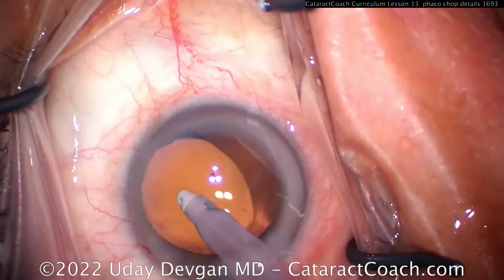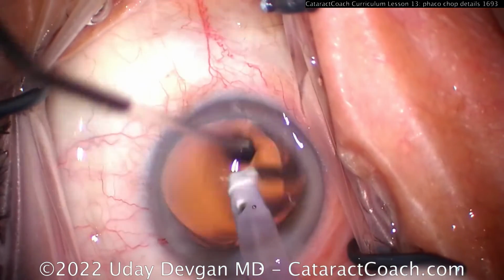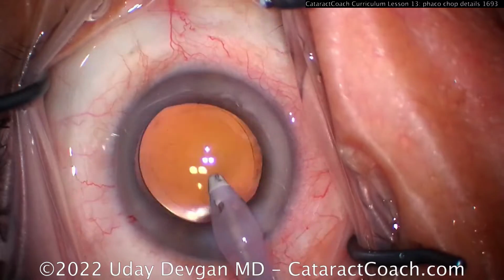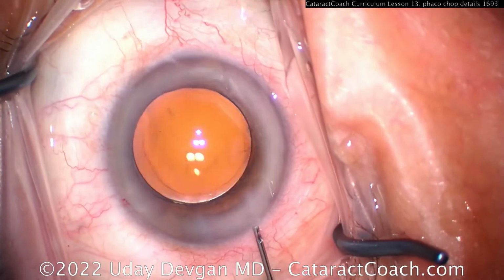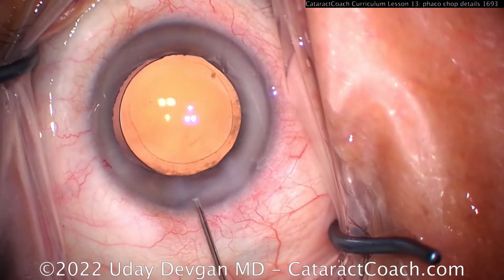But you really are doing a bit of a power wash, and that's why you need the higher flow rate. So that's it for the settings. There's no magic there. The technique is far more important than the settings. And if you have an understanding of the settings, then you can choose your own settings more appropriately.